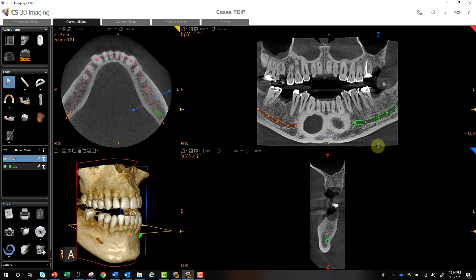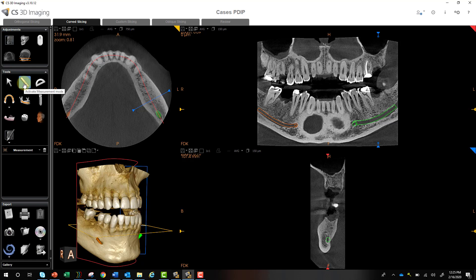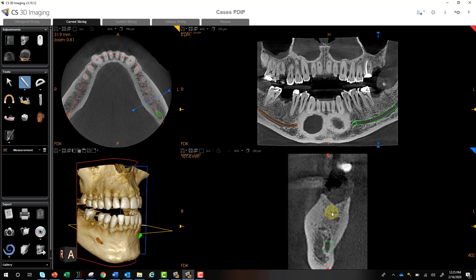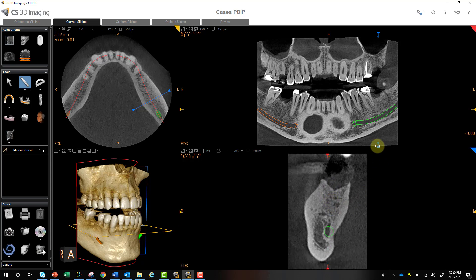Hey, this is Phil and this is part two of implant planning. We've created our panoramic curve and we've mapped our nerve. So what next? Let's go ahead and take some measurements — there are a couple of ways you can do this. You can select your ruler, zoom in, and find where you want to take your measurement.